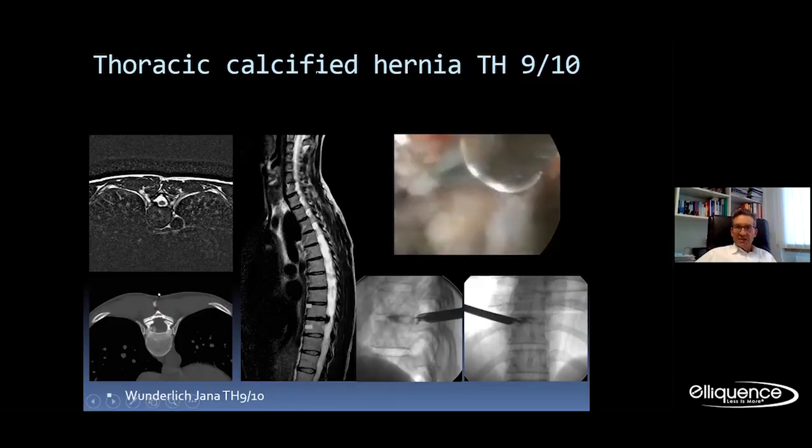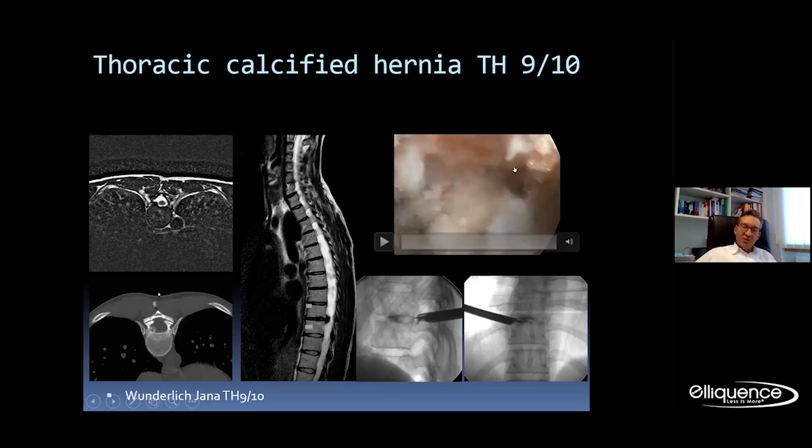You see, especially in this case, how safe the radiofrequency is. We work very close to the spinal cord thoracically, and we use the hemo mode and in short bursts, so we can really stop any bleeding in the spinal canal without affecting the spinal cord.